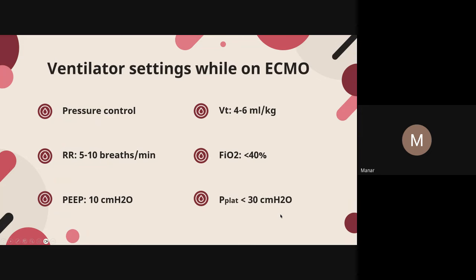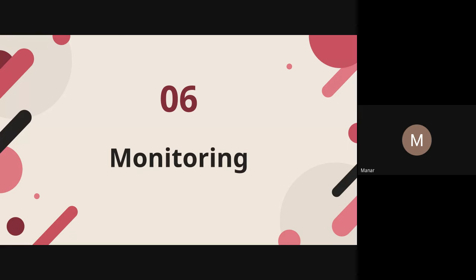And I'd like to also talk about prone positioning. Now, I haven't put it on the slides, but it's very important to consider prone positioning when we can because it does improve oxygenation, especially that we're using a whole external machine to improve oxygenation. So just why not incorporate another oxygenation improvement modality? So next, I will talk about the monitoring.